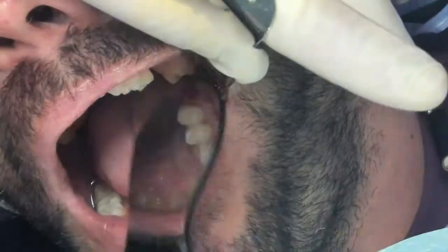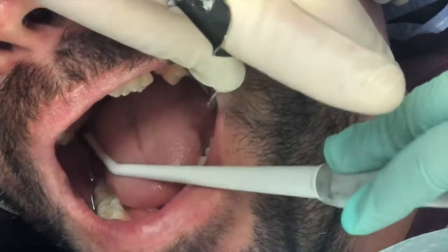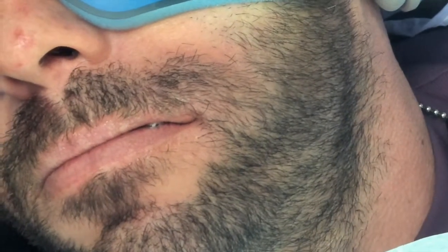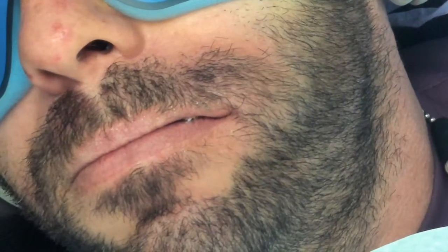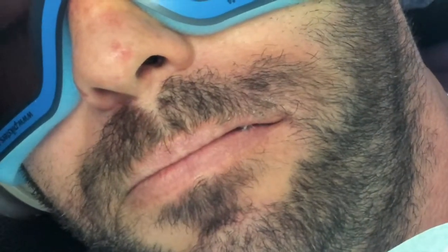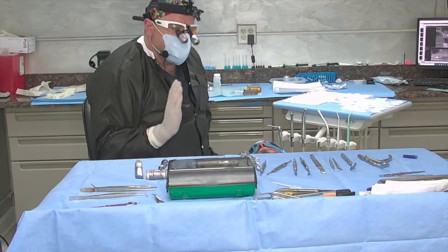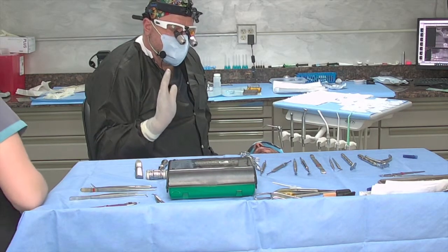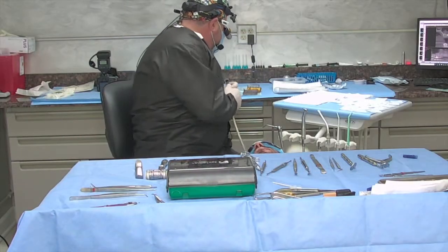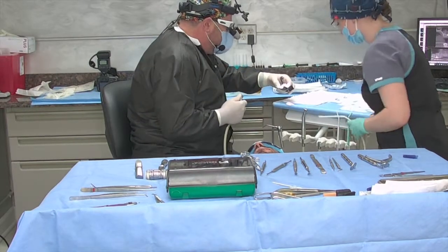And that little pouch of tissue for me, go ahead, bite down, relax for a second, is ideal to manage either with the width of the collar of the implant, or I can look at putting graft. Remember from the literature that as long as we have 1.8 millimeters of bone on the facial of an implant, that's what's adequate to develop the periosteum and have good blood supply to your buccal plate. With zirconia implants, we have a lot of flexibility with that, but I like to adhere to that measurement as close as possible. So now we're going to switch out our burrs, and I'm going to start this internal procedure.